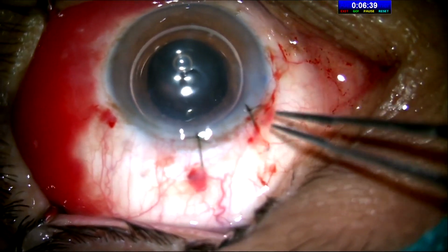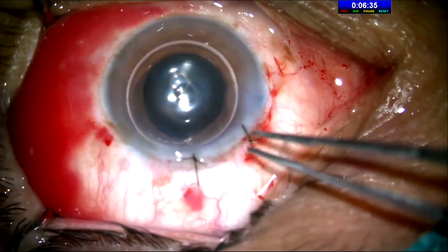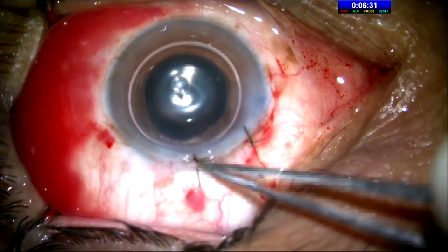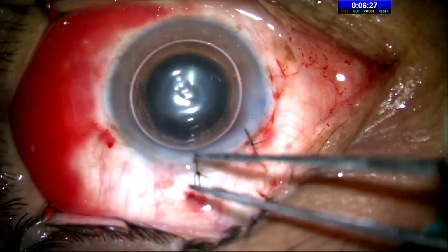So this, I say, is the fastest and a good enough surgery. Take the knot backward, not in the cornea. And silk doesn't hurt like a 10-0 nylon. The 8-0 doesn't produce papillary hypertrophy.